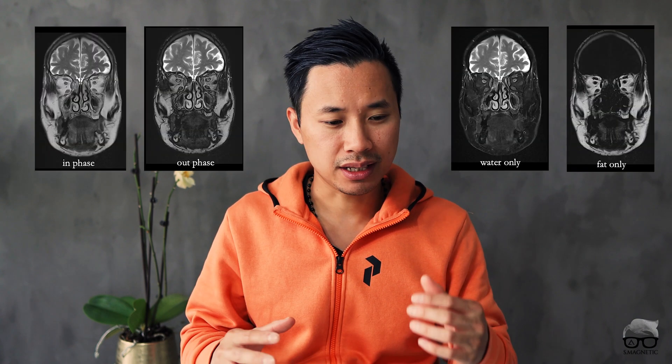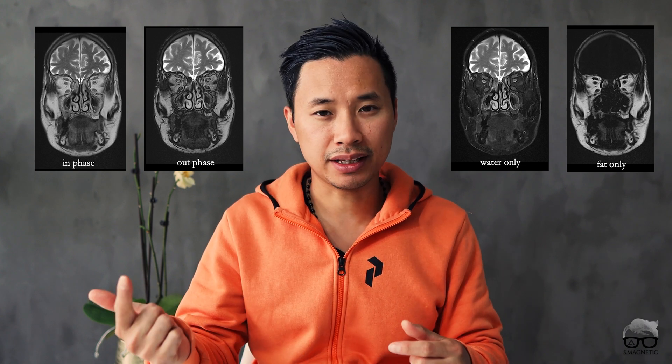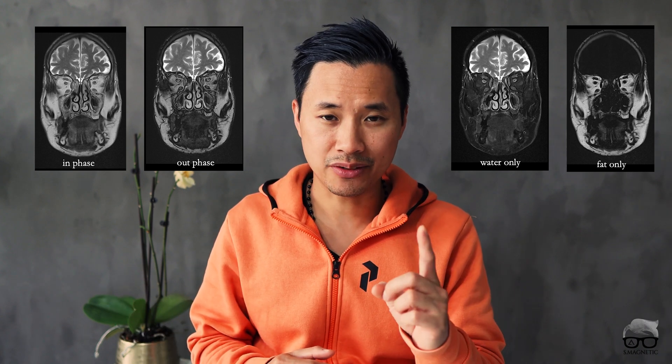At our site we use 2D Turbo Spin Echo Dixon a lot. It's a T1 PD or T2 sequence because radiologists really like the images — you get another phase and then water and fat only with one simple scan. The water-only is very robust against inhomogeneity and gives good fat suppression.